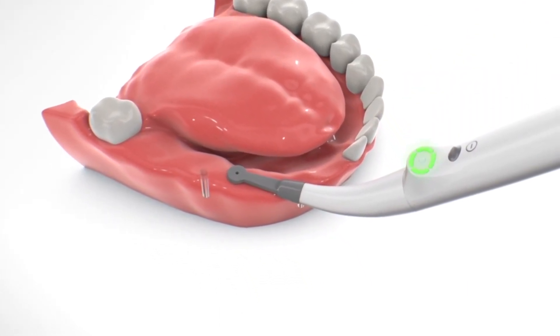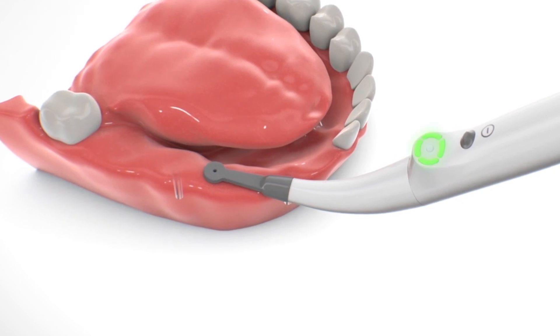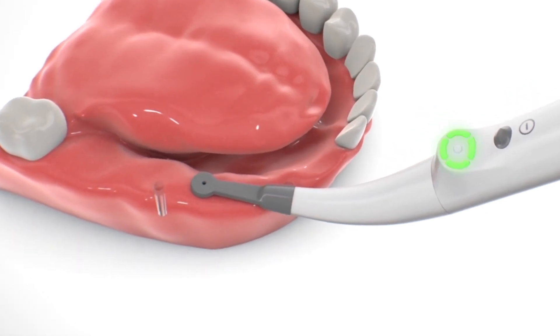Place the sensor plane onto the gum at some distance from the estimated position of the implant. The central hole of the sensor should be approximately in the middle of the jaw ridge.